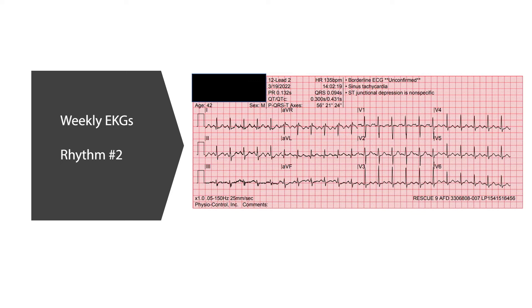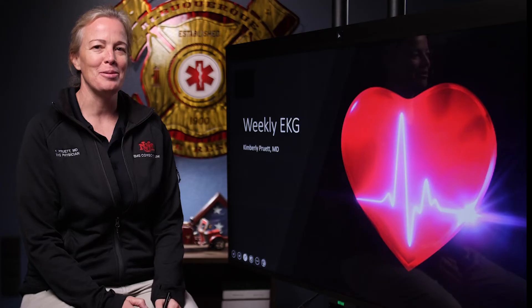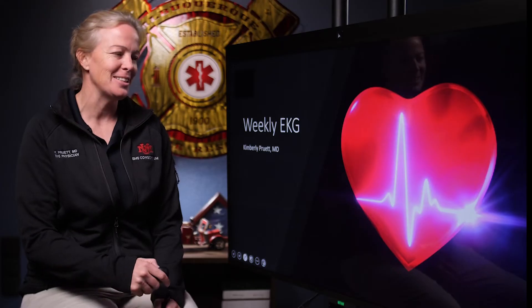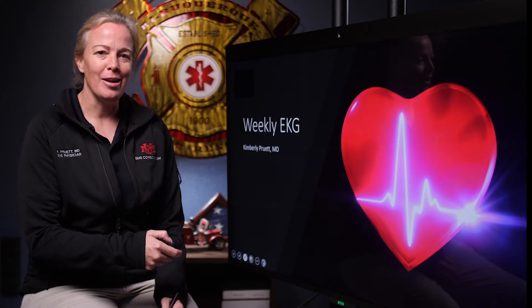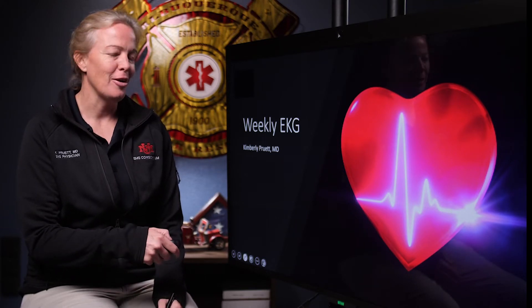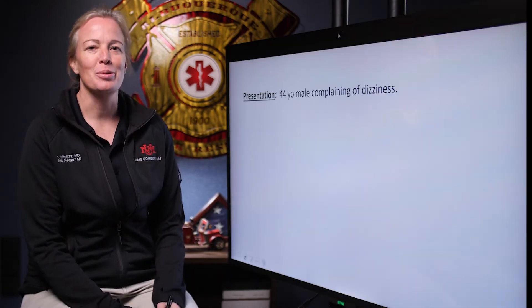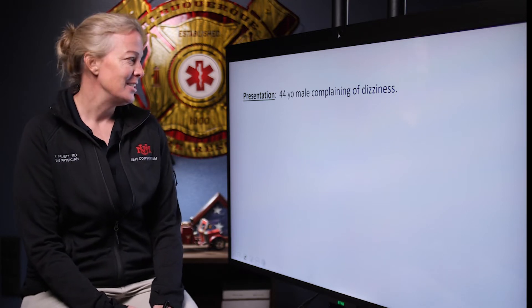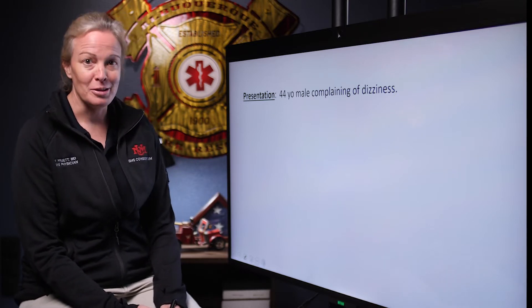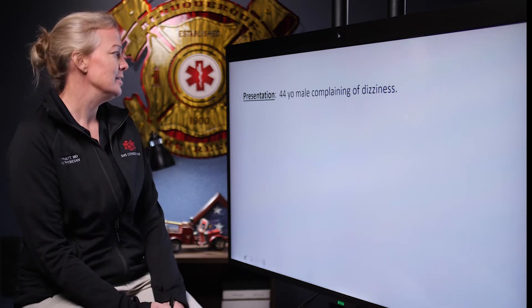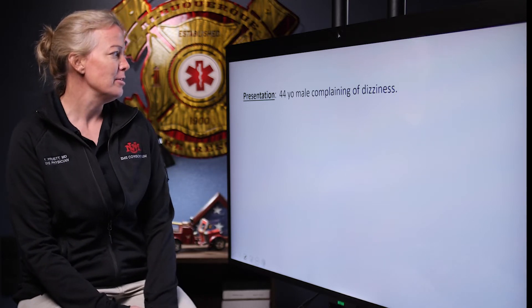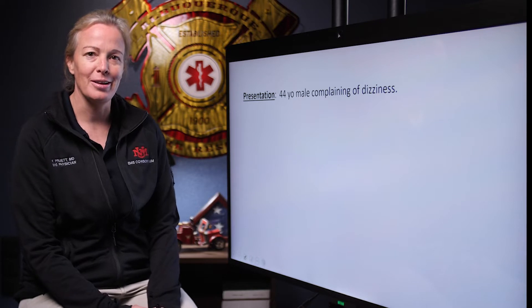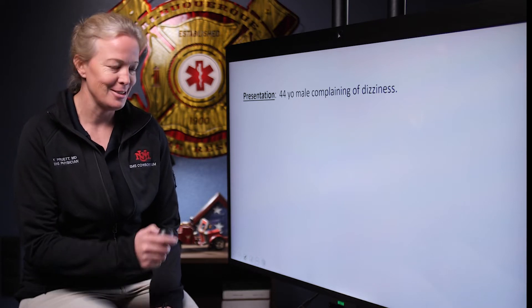Hello everyone, welcome back for our next weekly EKG. We're still starting off with the basics to get our rhythm down and our foundation for interpreting these together. Our only case today is going to be a 44-year-old male who is complaining of dizziness.